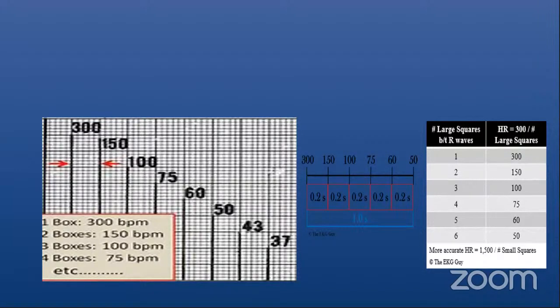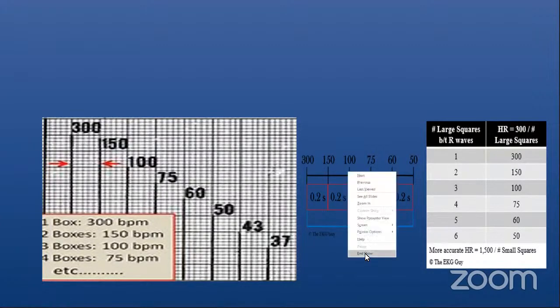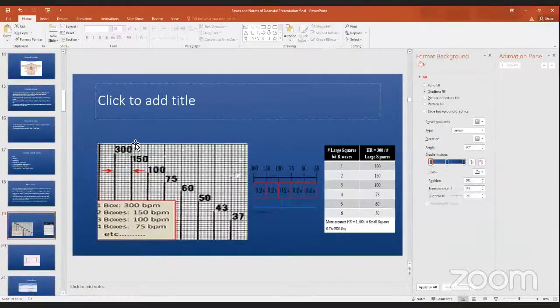Okay, so as per my knowledge, in units there are electrodes to be attached to the legs on the medial side. Is it so, or can anything else be done for ECG in a better way? Sorry, say that again. Electrodes to be applied at the limbs to capture ECG.